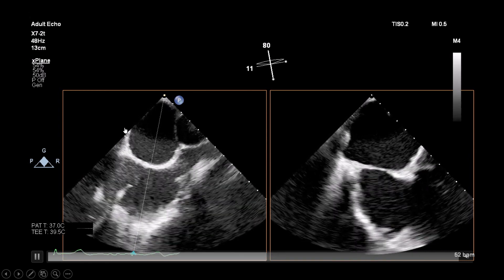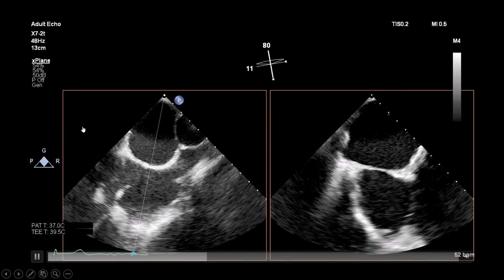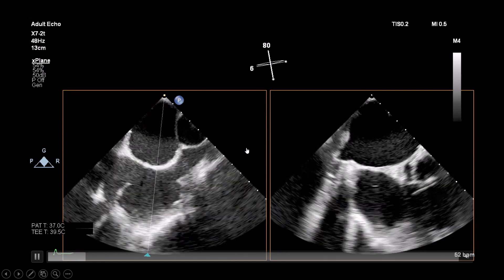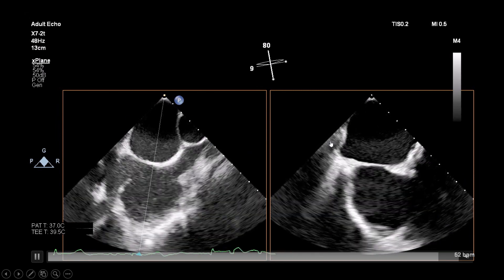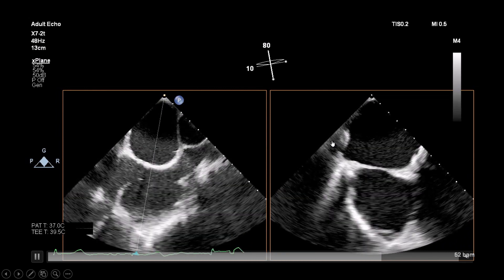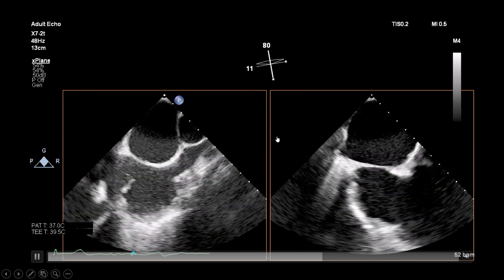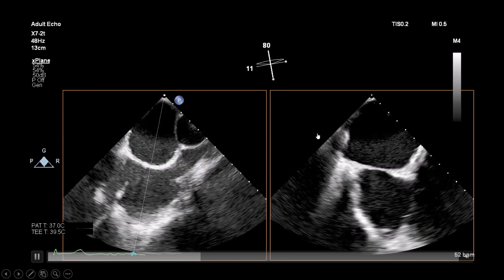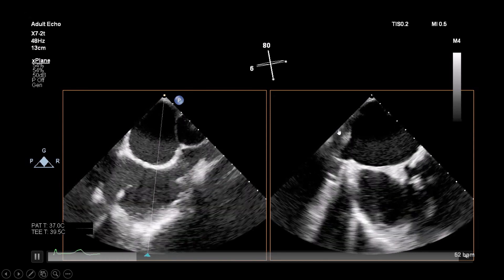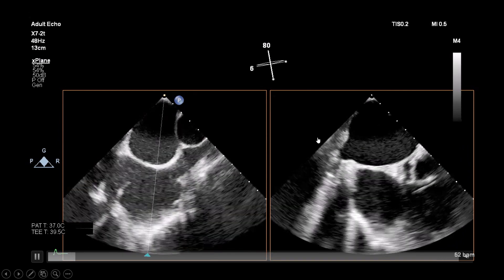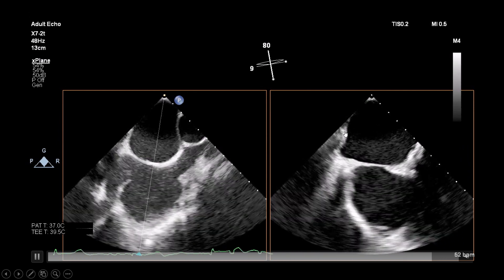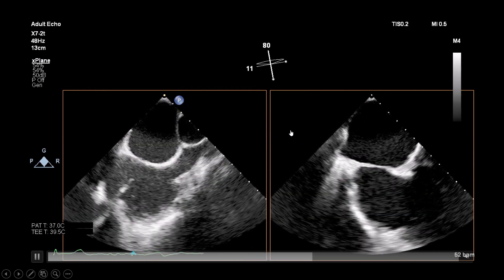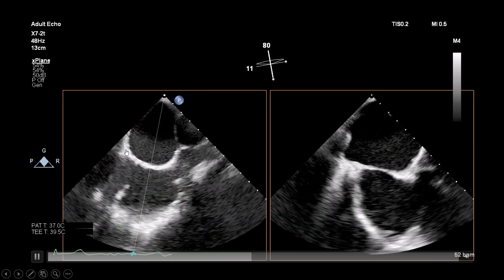Assessment of the septum is very important. Here is the bicaval view — superior vena cava, inferior vena cava, left atrium, right atrium, and this is the Eustachian valve. Putting an X-plane into this gives you something like the short axis basal view, with the aortic valve to the right and the posterior part of the septum to the left. You can right-invert that to match the common display, keeping the aortic valve to the right and the posterior septum to the left, so that anterior, posterior, superior, and inferior are oriented accordingly.